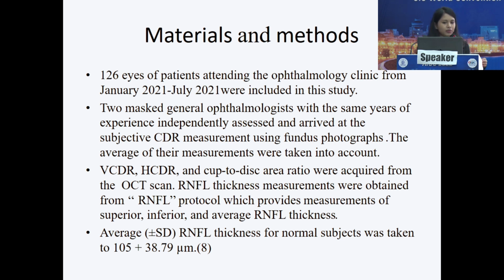In the study, 126 eyes of patients attending the ophthalmology clinic from January 2021 to July 2021 were included. Two general ophthalmologists with the same years of experience independently assessed and arrived at the subjective cup to disc ratio measurement using the fundus photographs. The average of their measurements was taken into consideration.